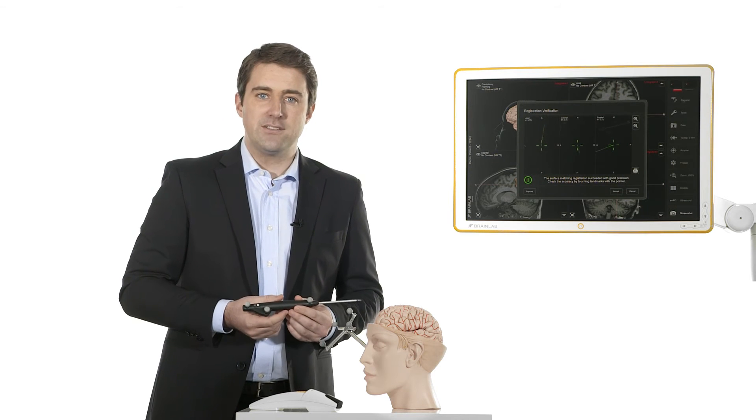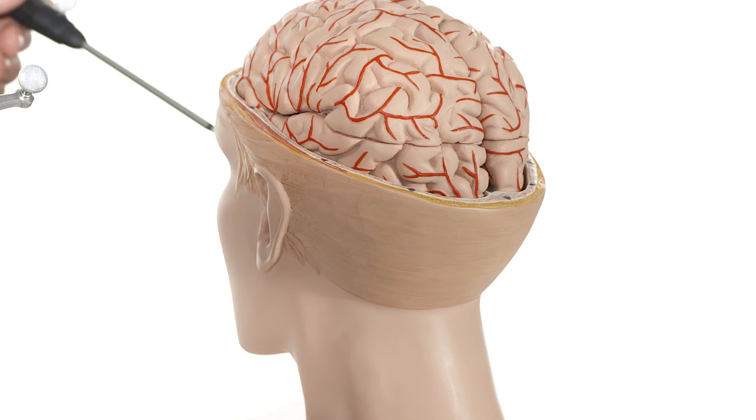The Soft-Touch pointer can also collect individual points upon skin contact when the patient's face is not visible to the camera, particularly helpful in prone position.